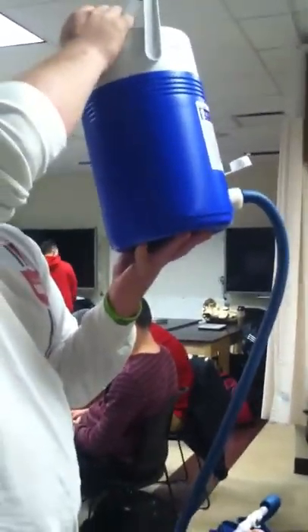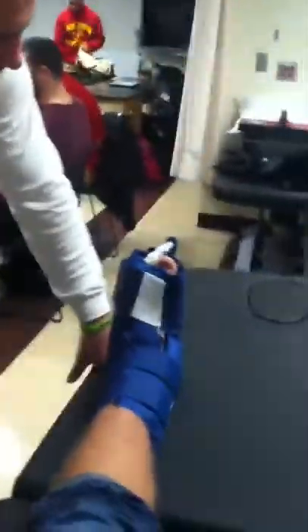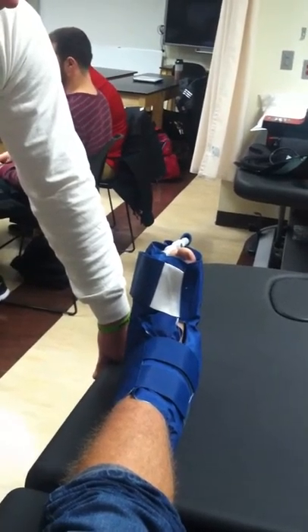When you want to remove it, just put the container down here and the water will flow right back out. And that's how you apply a cryo cuff for an ankle sprain.